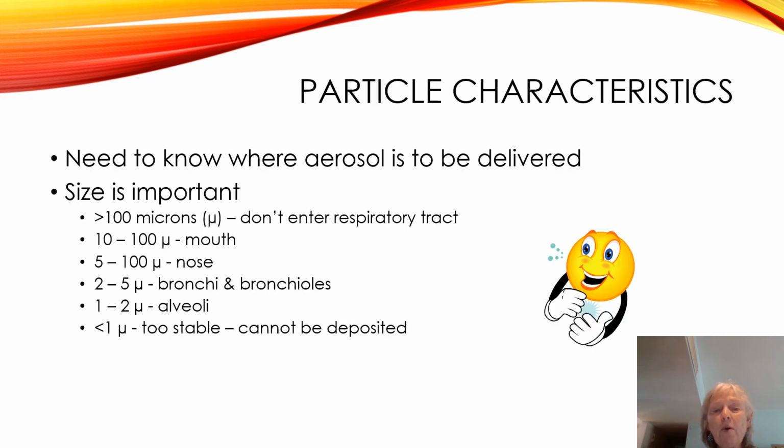So we talk about particles. Particles, remember, are aerosols, and that's your definition of aerosols. And so when we talk about medications, one of the things we need to know is, where's this aerosol going to be delivered? Is it going to the upper airway? Is it going to the lower airway? Or is it going to both of them? And so as a result of that, we need to know what size this particle is going to be.